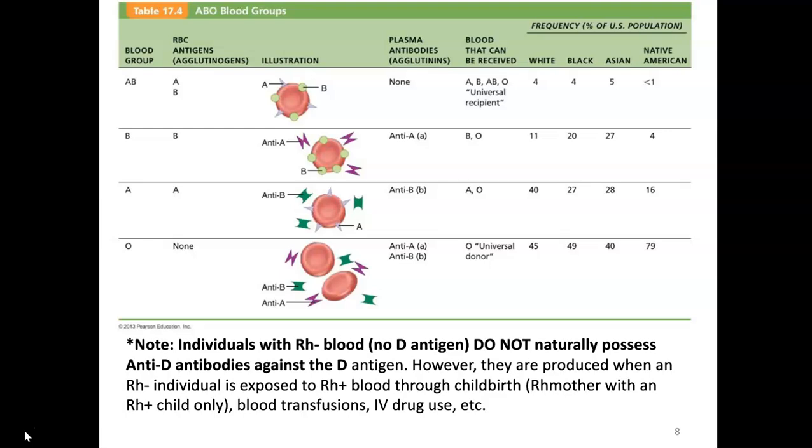Since we're not in lab, unfortunately, we can't do the whole blood typing lab, which is pretty cool because a lot of people don't know their blood type. But if you go on YouTube, I promise you can find a blood typing video. And if you've ever had your blood type done, then you know what's involved. I'm going to show you some pictures of how the blood typing is done.